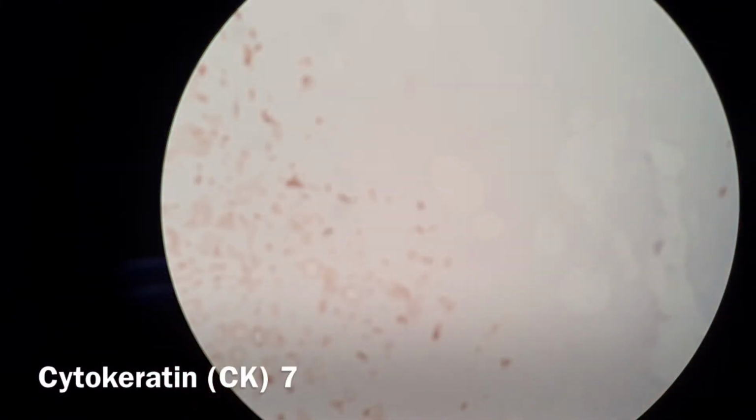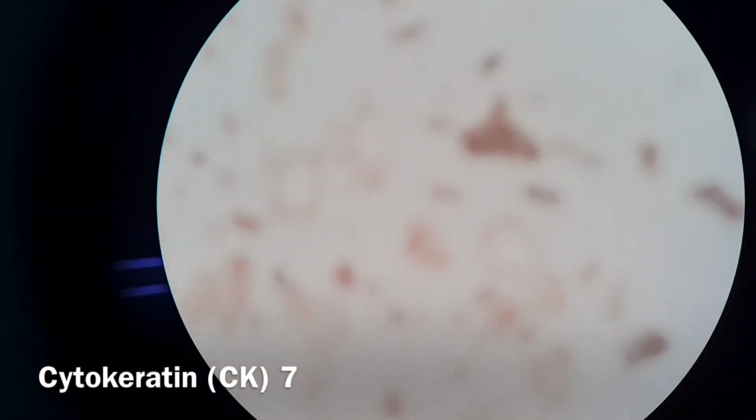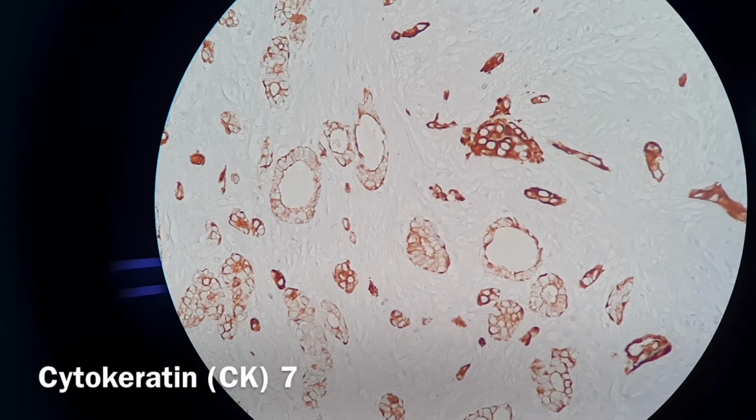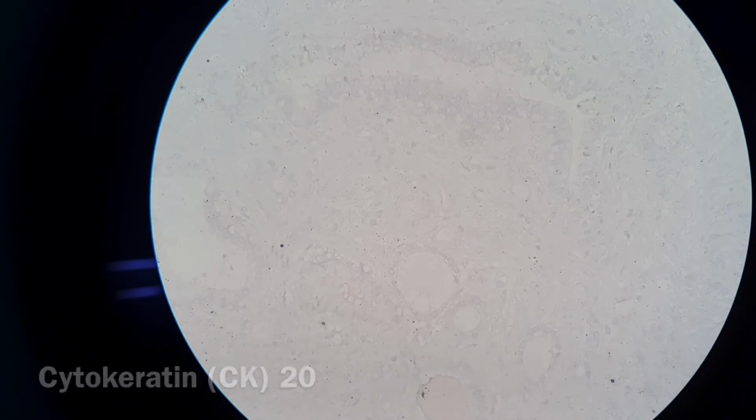So in this case, the cytokeratin 7 staining is positive. You can see all of the thyroid follicles, the carcinoma present within the marrow spaces, do stain with cytokeratin 7. The next stain is CK20. This will also help us narrow down and determine the primary site. In this case, CK20 is negative.